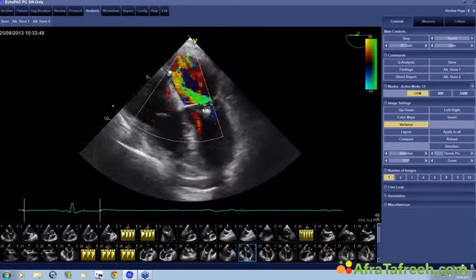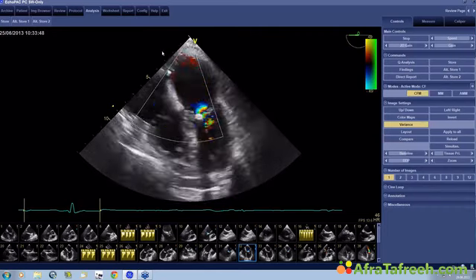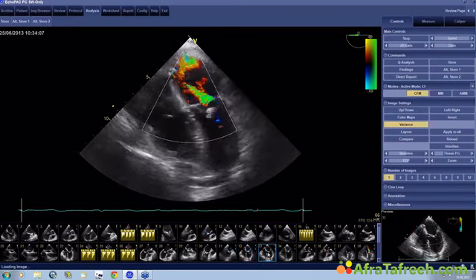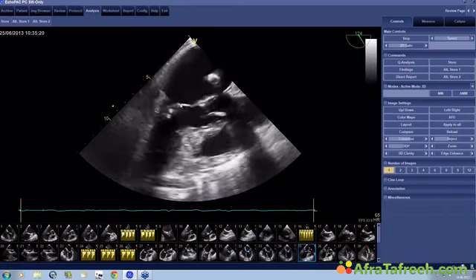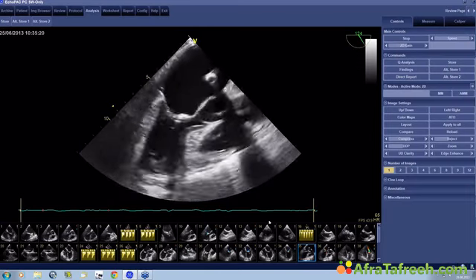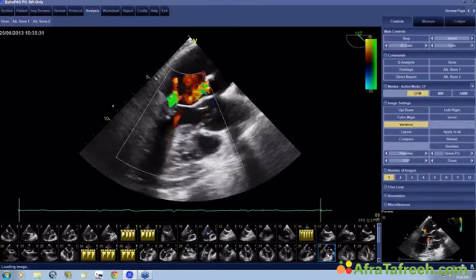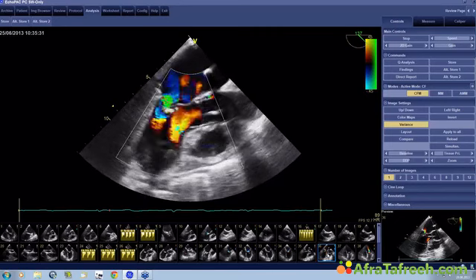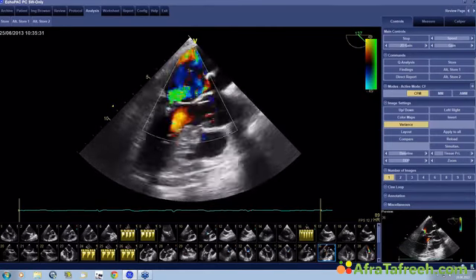Remember, before we performed valvuloplasty, there was no MR. Now this is massive MR. Look at this. Look how broad this jet is and how it really expands all the way to the back of the left atrium. So this is very severe mitral regurgitation. The valve itself seems to move okay. It's still stenotic, obviously. We never get complete relief of the stenosis, but in a certain sense, we should at least see a bit more opening, and it's kind of difficult to see that there was more opening.